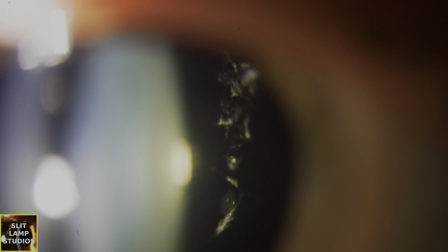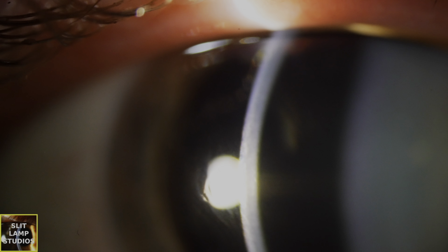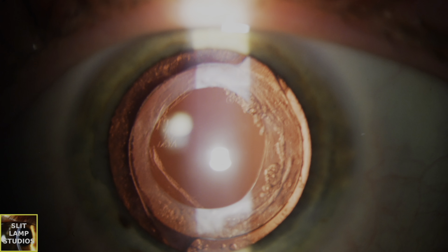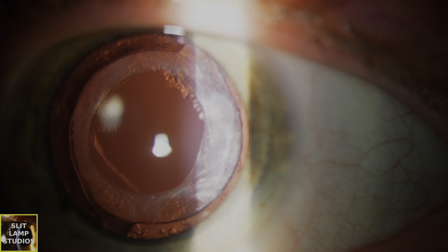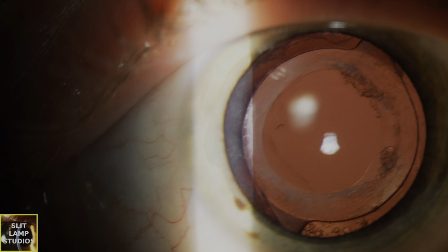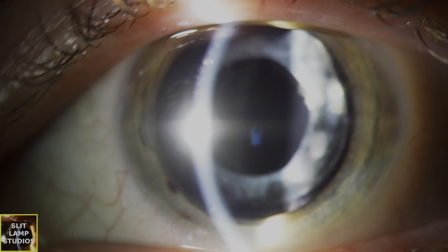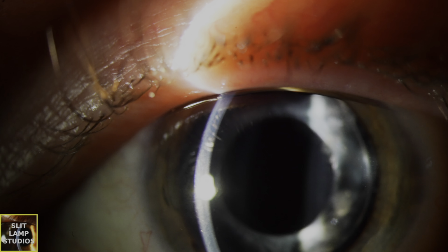It looks different. Certainly we can see some pigmentation and some Shafer's positive sign because this patient has had a previous tear, but actually this patient does have these abnormal beaded strands and this irregular thickened stranding with almost this kind of beaded appearance. That's appearing almost like a type 2 Stickler's syndrome.